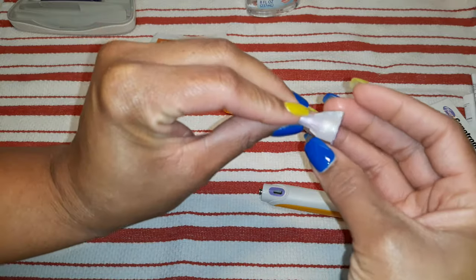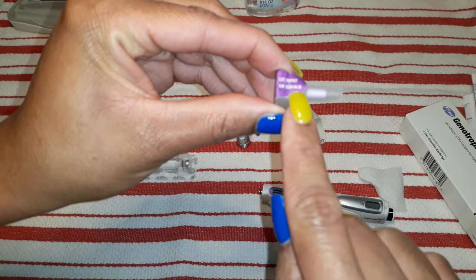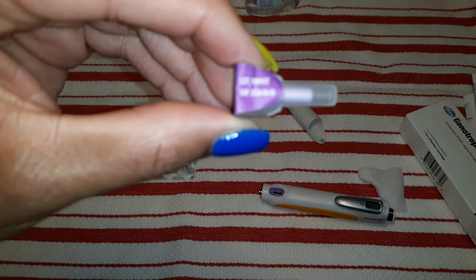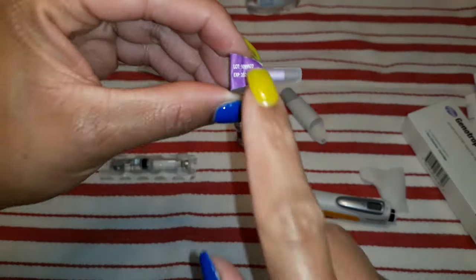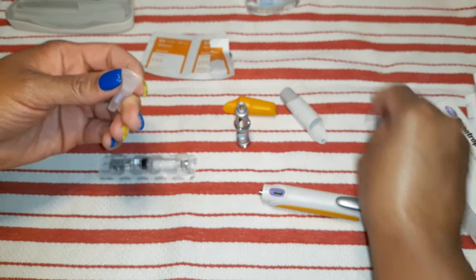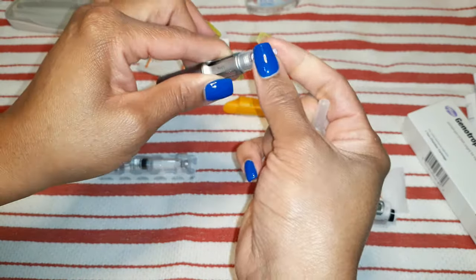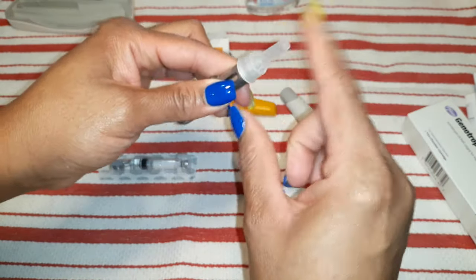And then I have here a sterile needle. Just in case you guys didn't know — because I did not know this — these needles actually have an expiration date. I don't know what happens to a needle once it expires, but you probably don't want to use it. You just twist it on there. I'm going to take this little purple cap right here off, expose the needle, and put the plastic cap back on.